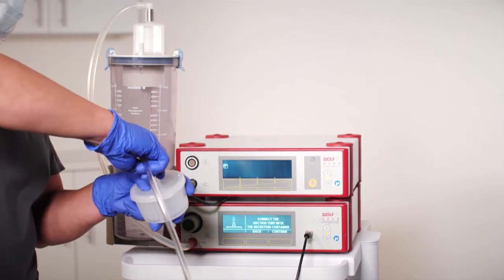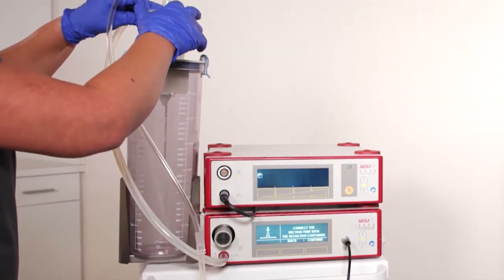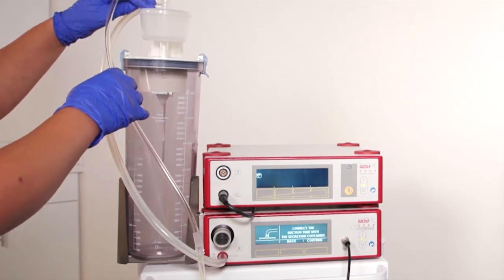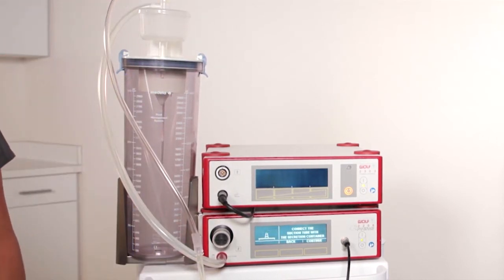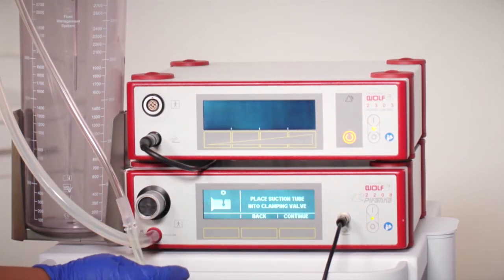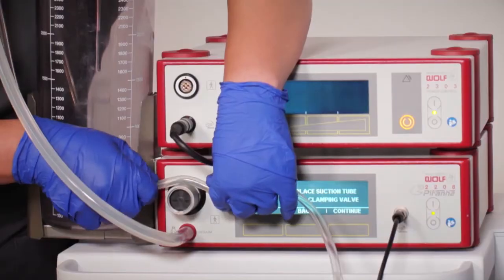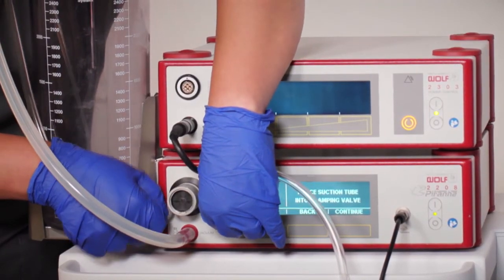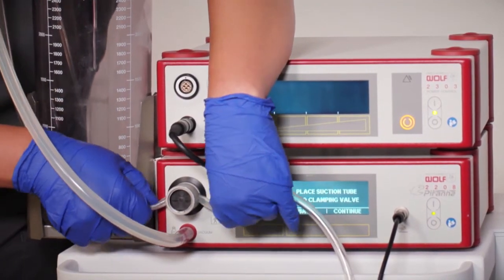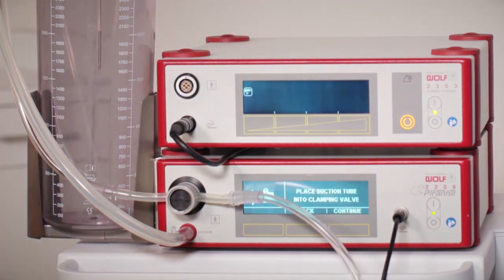The non-sterile team member will connect the elbow end of the suction tube to the tissue trap, then connect the tissue trap to the secretion container. The non-sterile team member may now press continue. The suction pump screen indicates place the suction tube into clamping valve. The clamping valve will open. First center the silicone portion, then pull straight into the clamping valve to prevent any tears in the tubing.